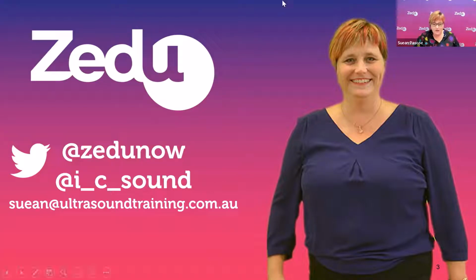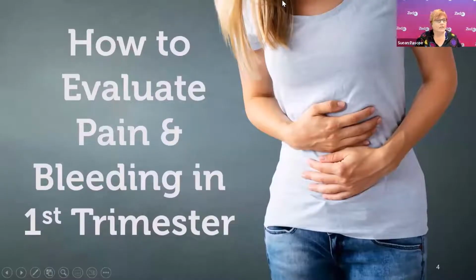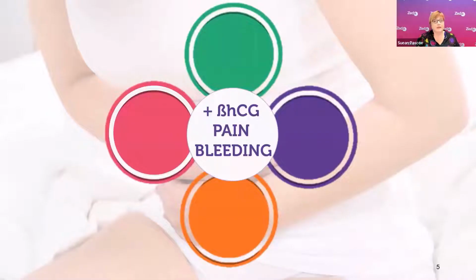So tonight's topic is going to be how to evaluate pain and bleeding in first trimester. And I think this can be a tricky topic as there's many things to assess and they're kind of all happening at the same time. So I want to take you through my approach to the early pregnancy assessment scan to assess for pain and bleeding. Essentially, when a patient presents with a positive pregnancy test and they have pain and bleeding, there's one of four things that can be happening.